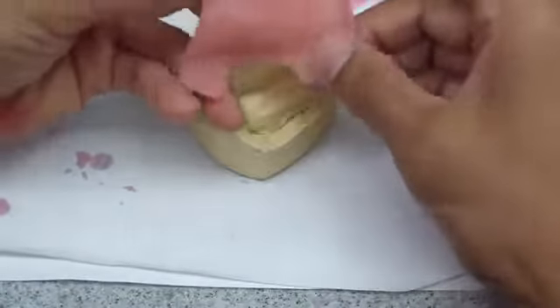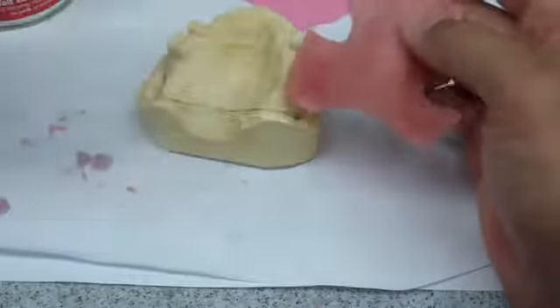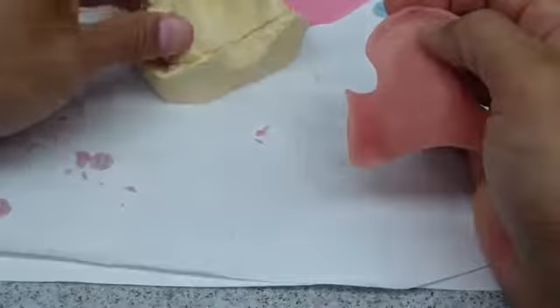And the second thing is, once you fabricate a denture base for a specific cast, this will not fit any other cast. So if you're planning on not mounting the cast upon which you fabricate your denture base, you're going to have to fabricate a new one, and I'll show you why, because I ran into that problem.